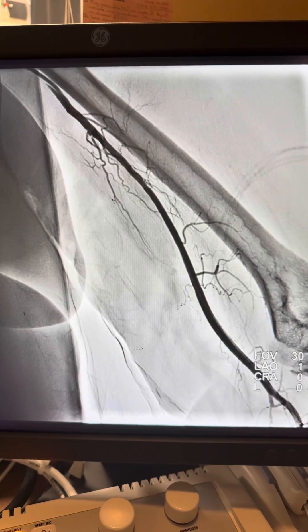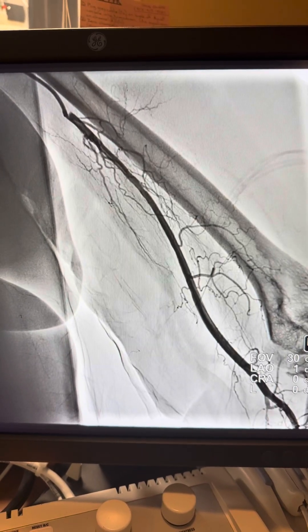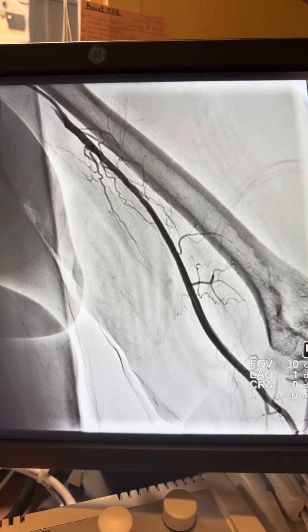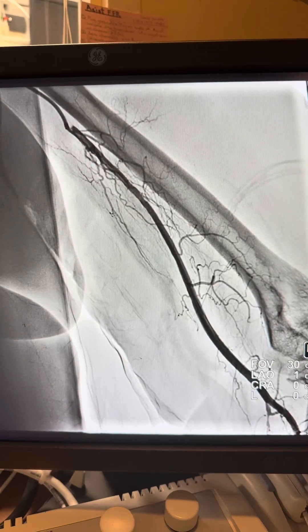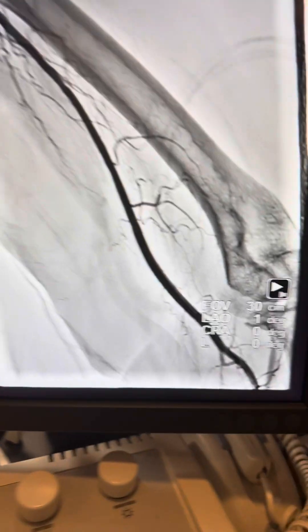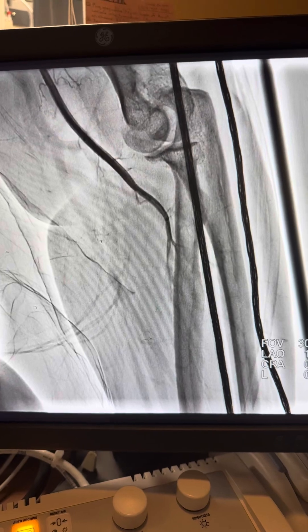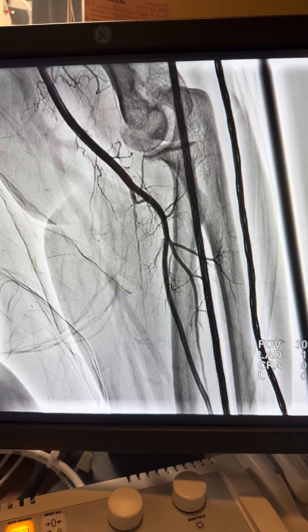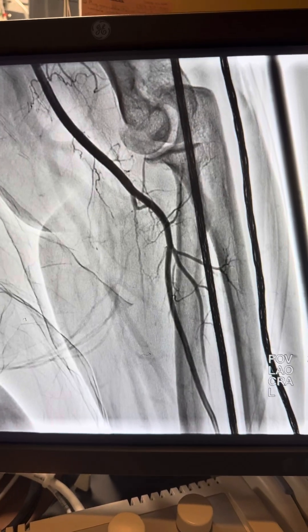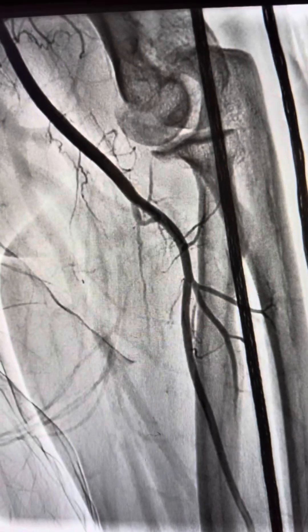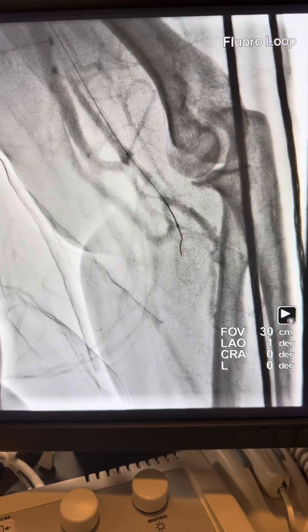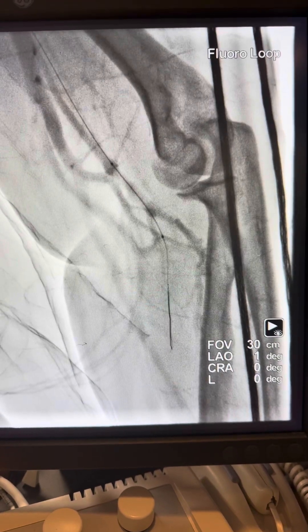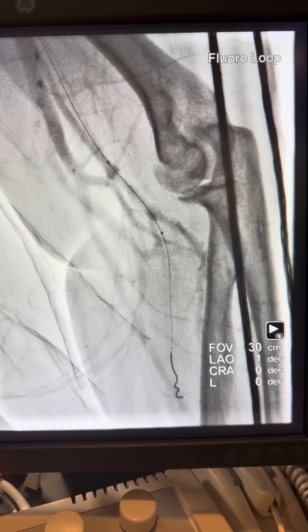After giving intra-arterial nipride and nitroglycerin, you can see improved flow. We then advanced the catheter more distally to intervene on the radial artery. Here is the distal injection — radial, no flow — confirming chronic occlusion starting at the proximal segment. We started the case with a run-through wire supported by the Terumo 2.0/40 balloon.